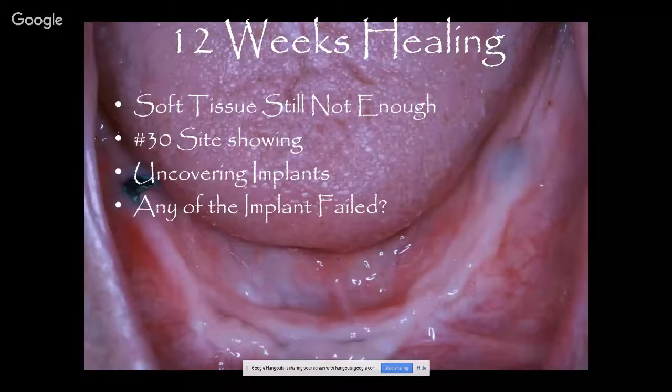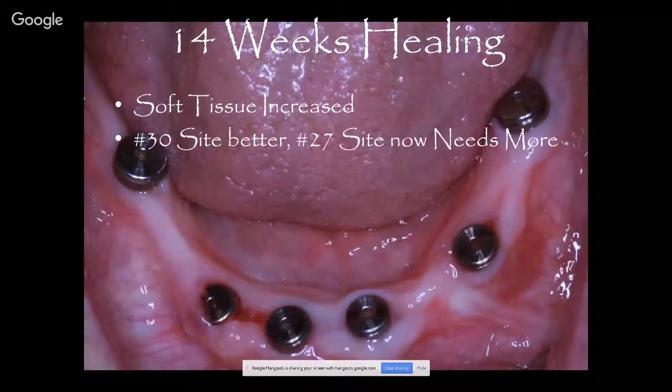So at 12 weeks, the soft tissue is still not sufficient. Number 30 site is showing through. At this point, I need to uncover all my implants, check if any of them have failed. And then what I'm going to do is just uncover these by making a horizontal incision across the soft tissue in these areas and placing a 4 millimeter healing abutment above it. Then it's on to the restorative process.